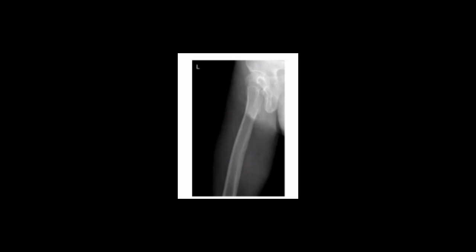Anatomy demonstrated. The proximal one-half to two-thirds of the femur, including the hip joint, is shown. The proximal femur and hip joint should not be superimposed by the opposite limb. For the collimation, make sure to collimate closely on both sides of the femur as well as to the IR borders.